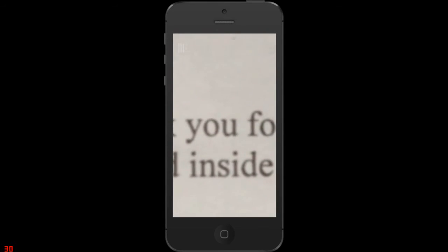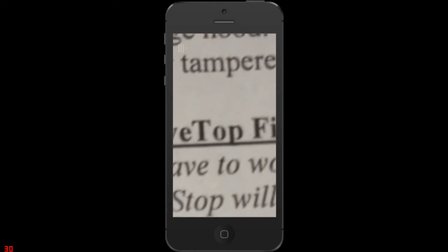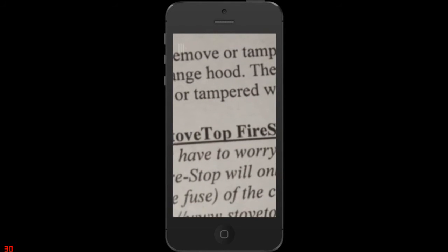But the other thing that I really like about this app is if I tap on the screen with two fingers one time, keep in mind I'm using all of these apps without VoiceOver because it focuses a lot faster and a lot of the things work better with VoiceOver off. So now that I have done that, I've hidden the interface and I can just pinch to zoom like when I showed you Safari and Mail and things like that. I can just pinch to zoom and my full screen, whether I'm using it in portrait or landscape, is magnified.